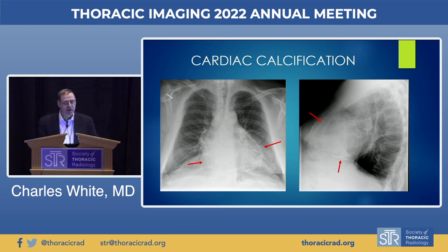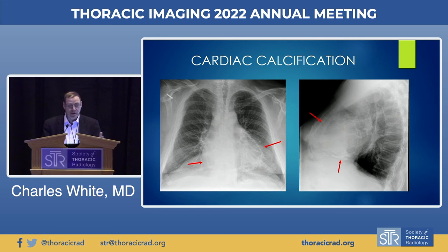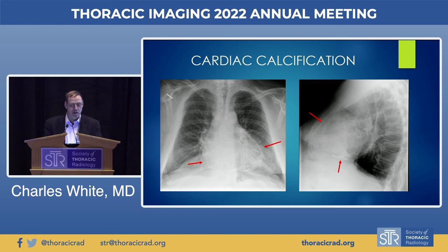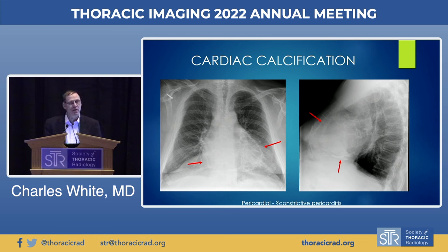If the calcification extends to the right side of the heart, perhaps in addition to the left side and anteriorly as well, then you might think of pericardial calcification, which often favors the AV grooves, the right side of the heart, and perhaps the left side. That's a good way of distinguishing myocardial from pericardial calcification. Clinically, when one sees pericardial calcification, one should give some thought to the possibility that the patient has constrictive pericarditis.